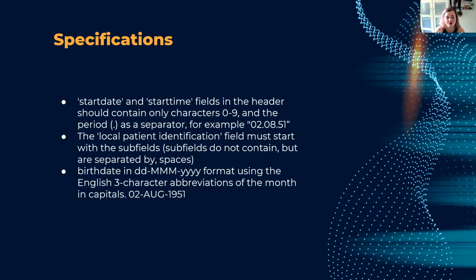However, this is not always there, because this is set up by the technician. So it depends on how the machine has been set up. Now, I know "it depends" is pretty much a forensic term that we use because there are so many variables. It's not guaranteed that you'll have all the information that I present today in an EDF file on your machine.